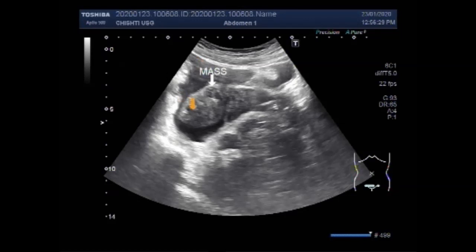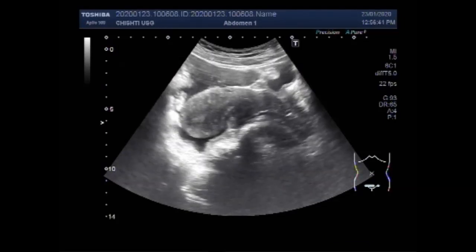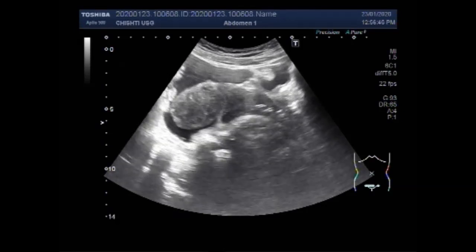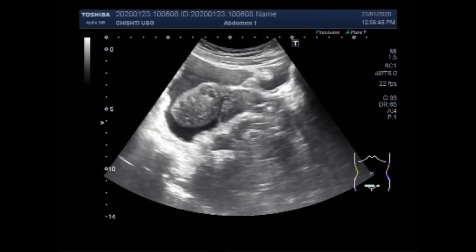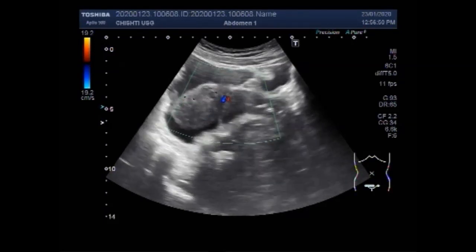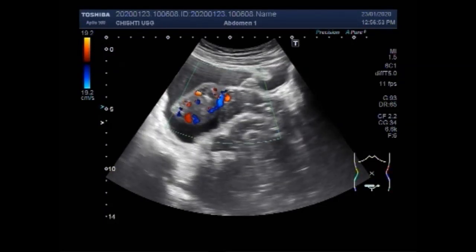This is a mass in the middle portion of the uterus, attached to the anterior wall. You can see the blood flow — there is considerable blood flow seen around the mass.